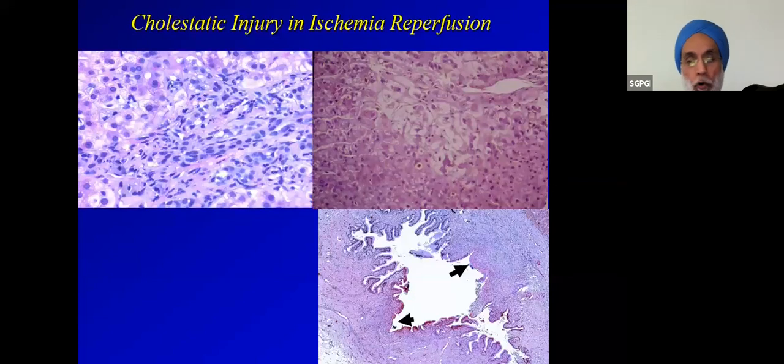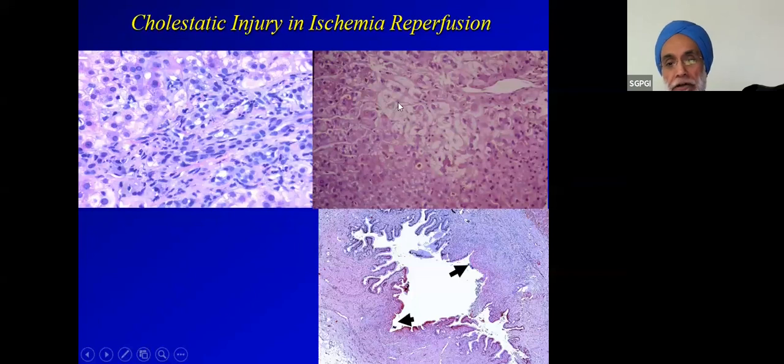So these are examples of cholestatic injury. These portal tracts are edematous, there's cholangiolar proliferation, there are neutrophils. That's actually what we saw in the case this morning where there was a stricture. You can get ballooning degeneration, even Mallory's hyaline-like change.